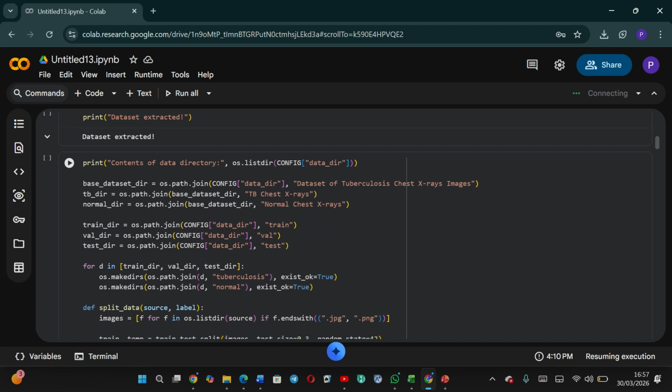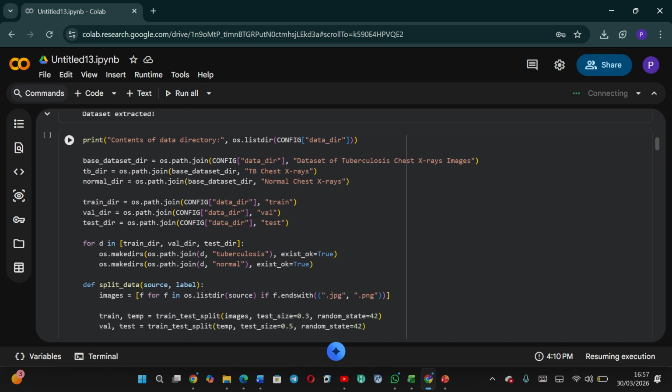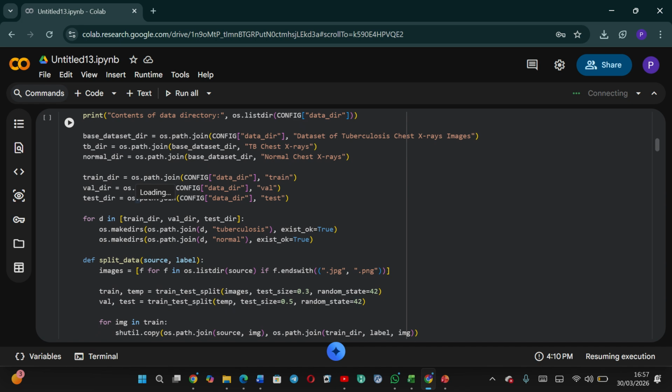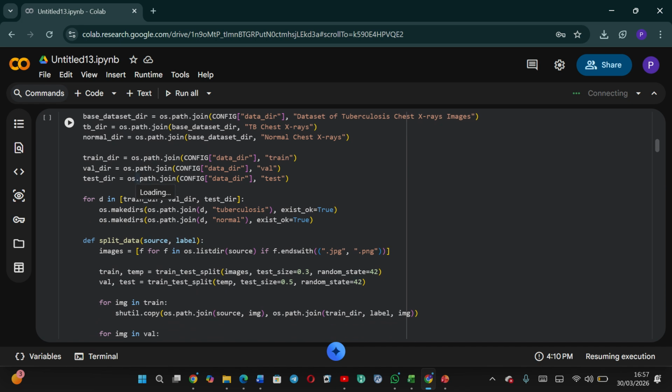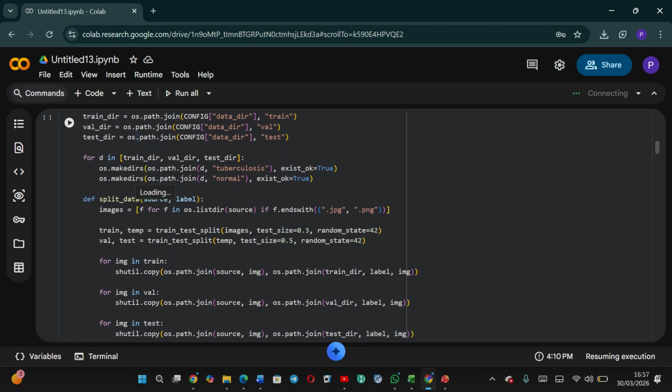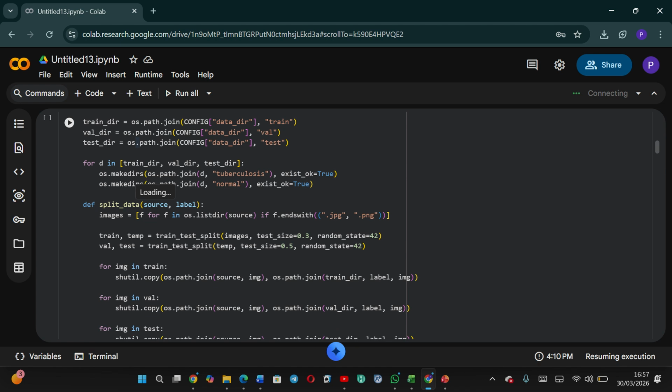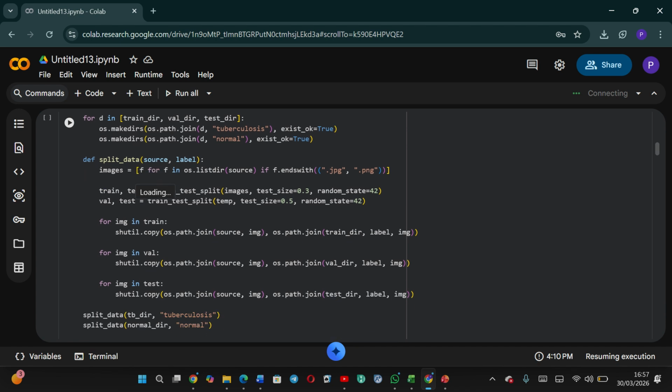In our next step, we organize the dataset into three main folders: the training data, validation data, and test data. We also define the path of TB images and normal images. This structure is important because deep learning models require well organized datasets for proper training and evaluation.